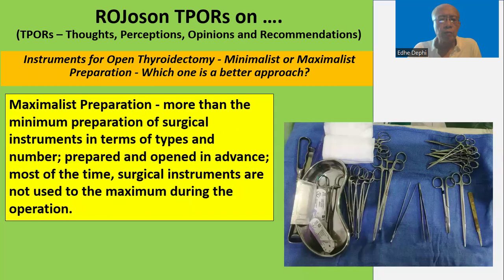Maximalist preparation means more than the minimum preparation of surgical instruments in terms of types and number, prepared and opened in advance. Most of the time, surgical instruments are not used to the maximum during the operation.